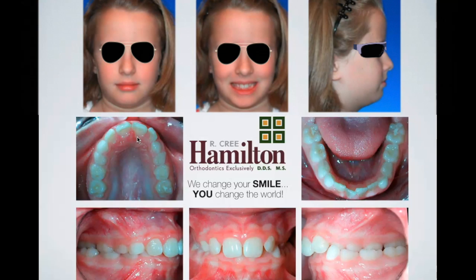So we have to think about the CRCO slide, the growth thing. That's a pretty good justification, right? Most parents are going to want to correct that. But based on crowding alone, what's another reason why this particular patient, and I haven't shown you a Ceph yet, that's your clue. I'm not going to show you a Ceph, but what's that? Yeah, she's upright. Those incisors are retroclined. Where are those going to end up? They're going to end up more proclined than they are now. As you procline, those teeth are going to have space.